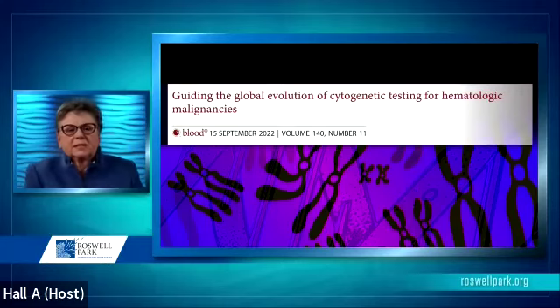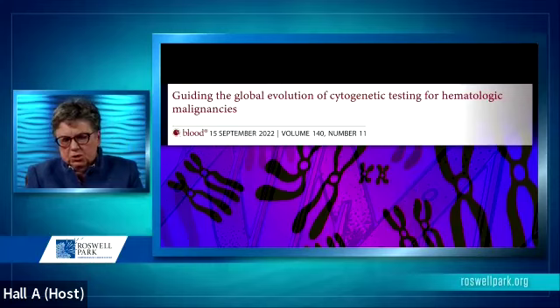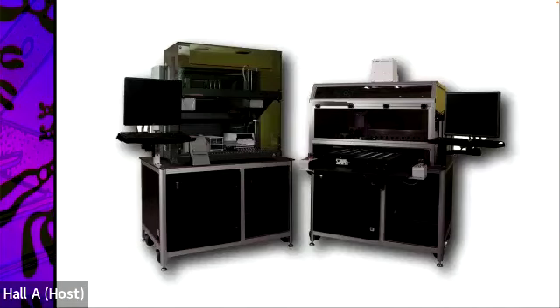Recently, a group of cytogeneticists initiated a discussion of where cytogenetic testing is going for hematologic malignancy. A lot of the discussion is based on the availability of talented individuals to perform these studies. In a sense, you have an issue of time-consuming testing as well as talented staff who are experienced enough to recognize these chromosome changes. Automation has finally reached cytogenetics.